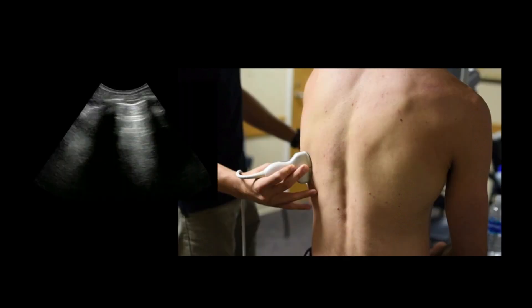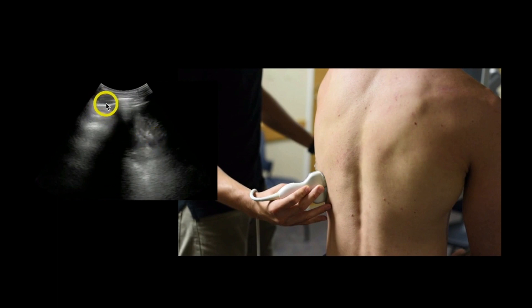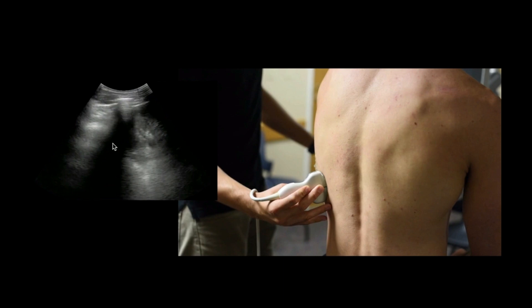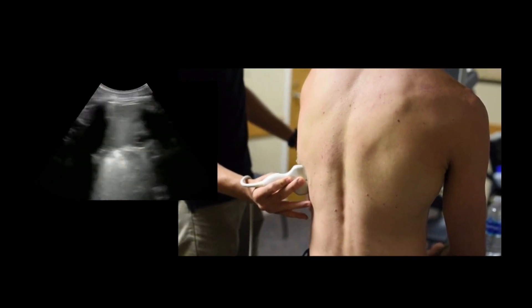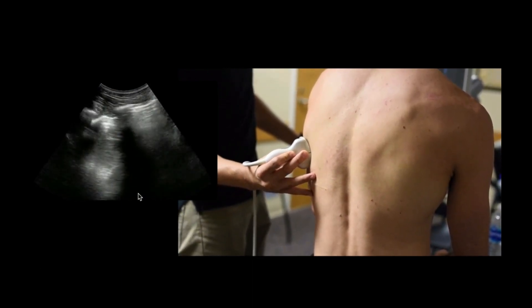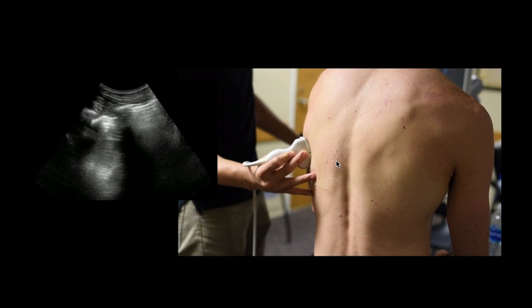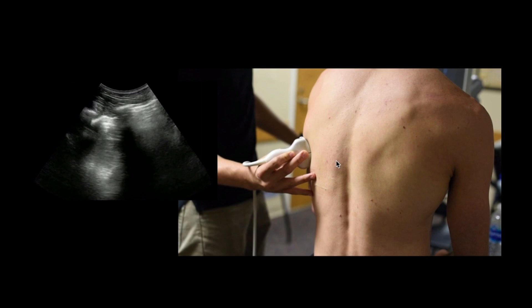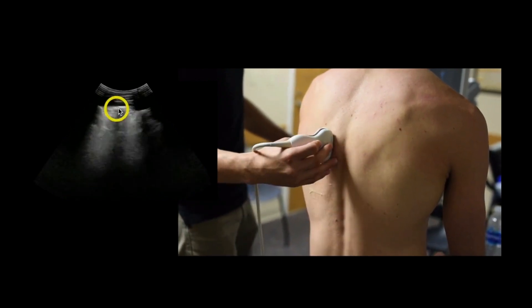The first thing I do is identify the most inferior portion of the thorax. Right here you can see the left kidney, and over here is the pleural line with some A-lines — that's basically where the diaphragm sits. I start here because that's where pathology is most likely to be present. Once I've found my most inferior border, I lawnmower back and forth along the intercostal plane. Notice that my transducer orientation is changing the whole time — I'm making sure it always stays at a 90-degree angle to the skin, since the thorax is like a cylinder, maintaining 100% contact of the transducer head with the skin.